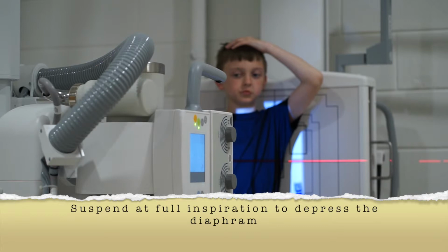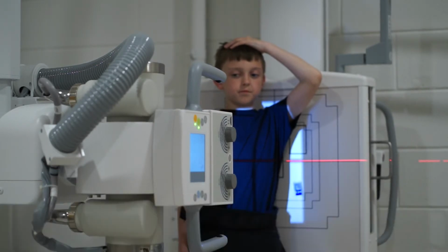All right, taking a deep breath and hold it in.